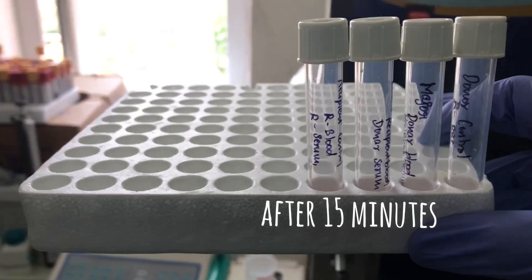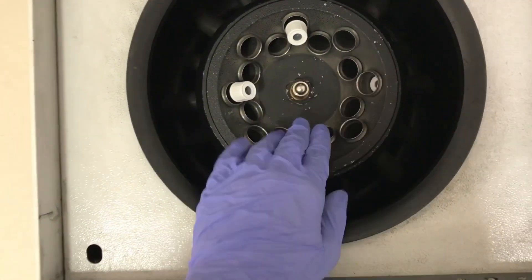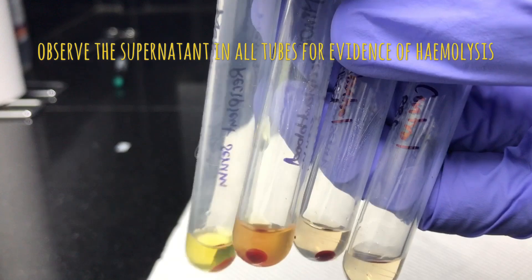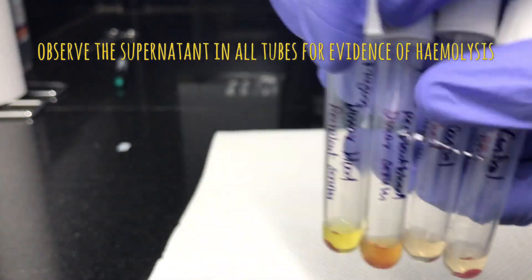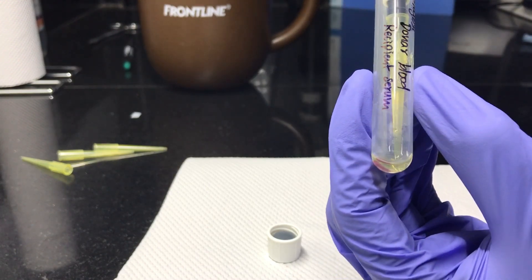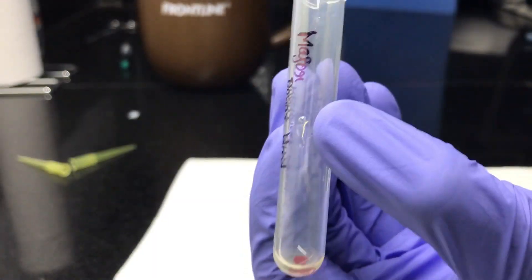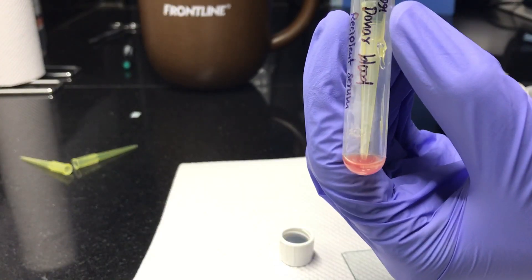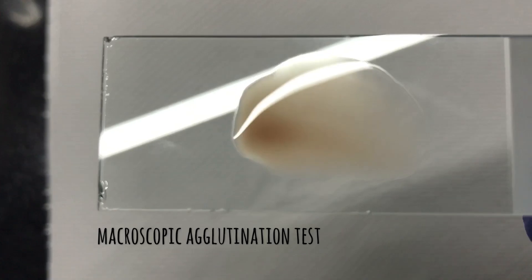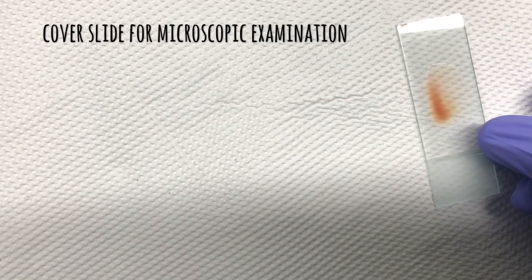After incubation, take out the samples and centrifuge for 1 minute. After centrifugation, examine the supernatant for hemolysis. Start pipetting out the supernatant until very little remains. Then mix the blood and plasma and place a drop on examination slides. Look for gross agglutination. If you don't see any, proceed with microscopic examination by adding a cover slip.